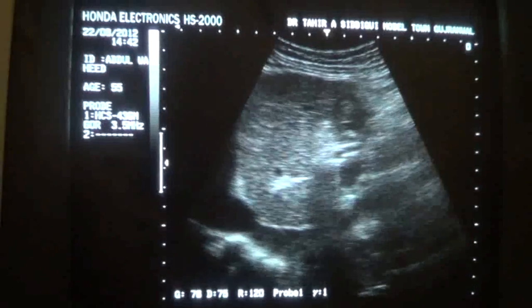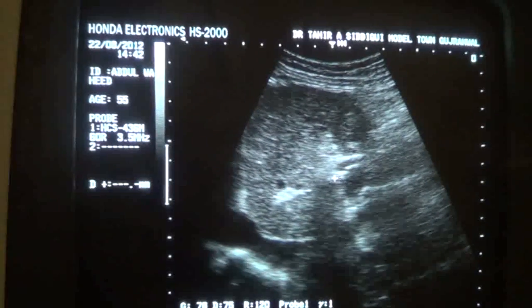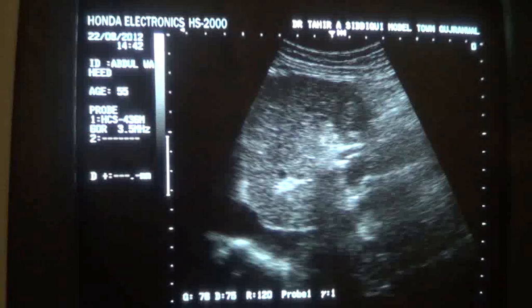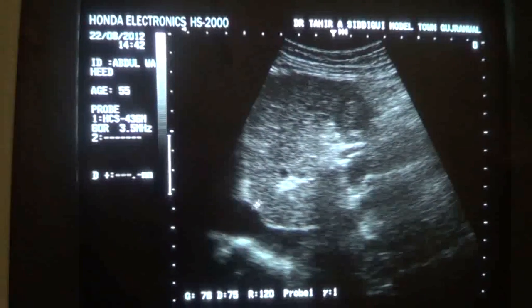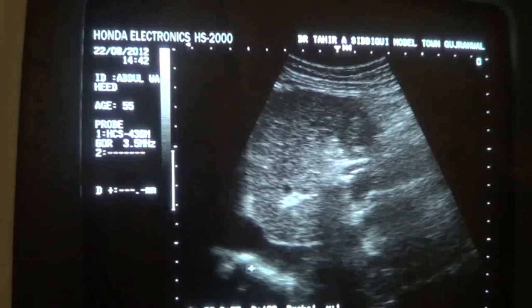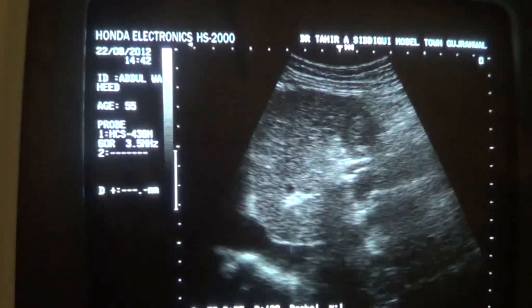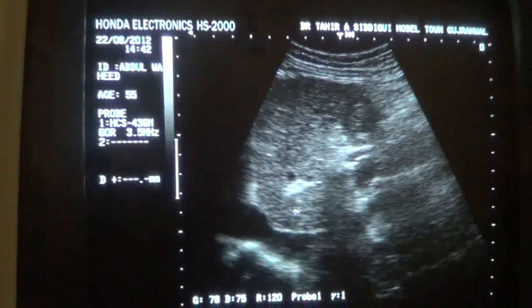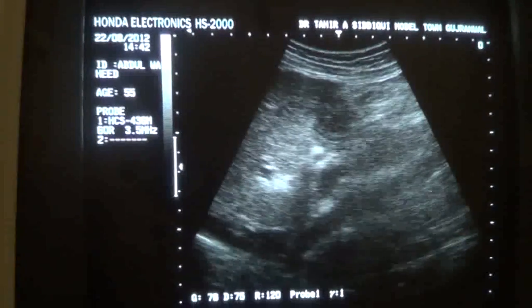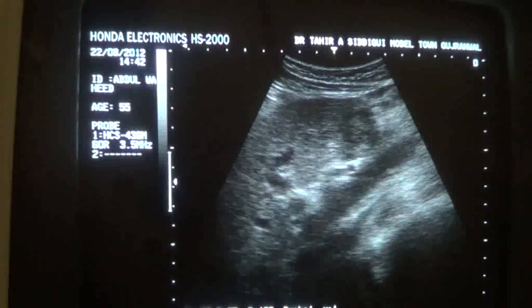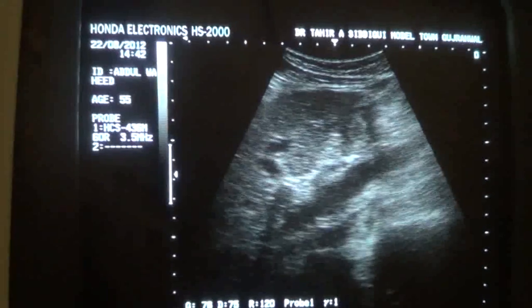This is the left lobe of the liver in longitudinal section. This is the ligamentum venosum. This is the inferior vena cava. This is segment one of the liver. The caudate lobe of the liver is normal.